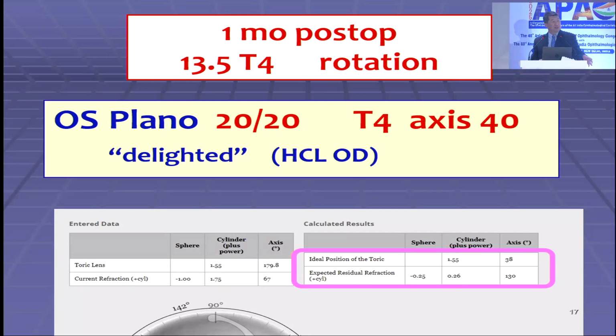So this is about mistakes and things. I should have put in capsule retractors. I should have used a spiral CTR injector, which is now available, wasn't back then. Maybe I should have left the lens alone. Anything else? What was so different about this case? Six months after surgery in a fairly young person, have you ever seen so little fibrosis?